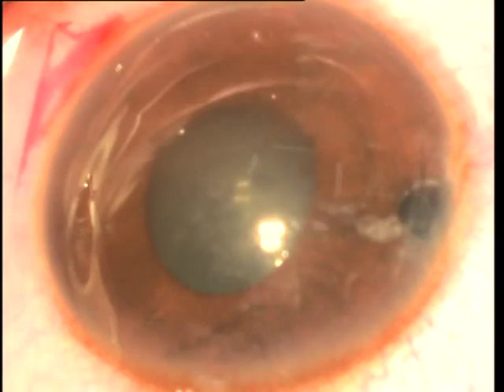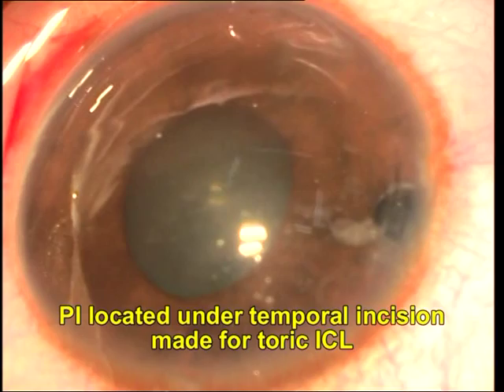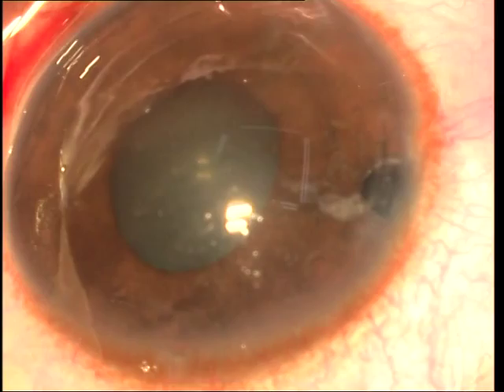Hi everyone, I'm Susan Jacob and I'm going to show you this interesting video of a young man who had undergone a posterior chamber phakic intraocular lens. Unfortunately, the peripheral iridectomy was made temporally, probably because the incision used for the phakic intraocular lens was also temporal, and this led to a problem.